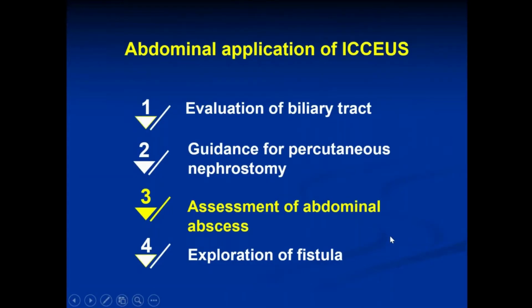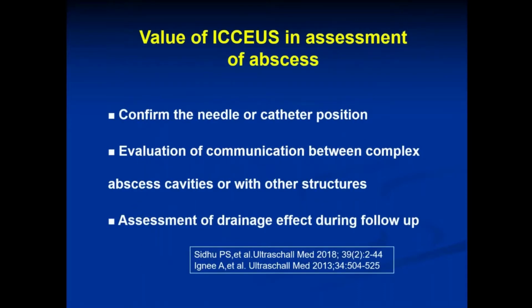And the third abdominal application of ICCEUS is assessment of abdominal abscess. ICCEUS can be used to confirm the catheter position, to evaluate the communication between complex abscesses, cavities, or with other structures, and to assess the drainage effect during follow-up.